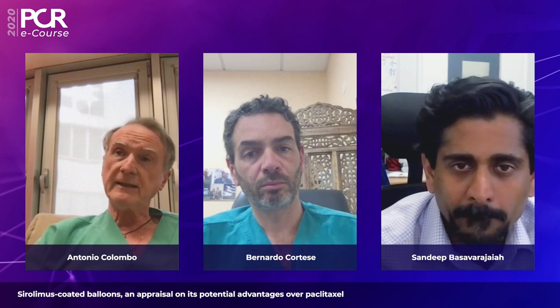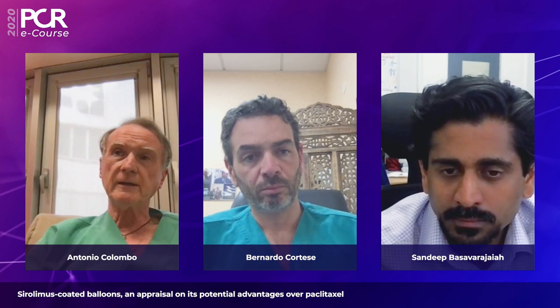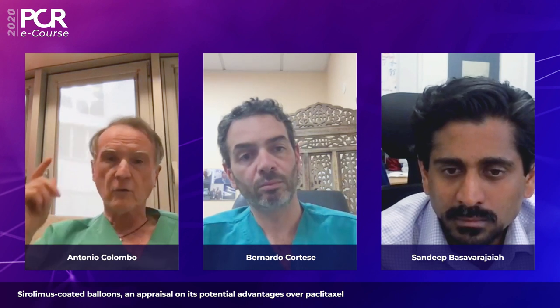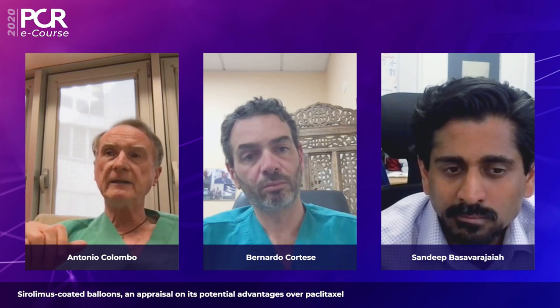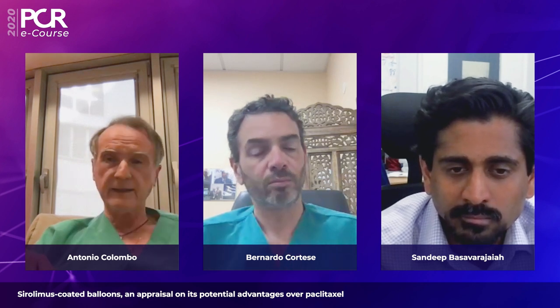And please do not dismiss also the fact that drug-coated balloon does not demand long-term dual antiplatelet therapy. And this technology, even if we did not cover this aspect in this symposium, is a good alternative in patients who cannot take a long-term dual antiplatelet therapy, who may need immediate surgery or some other procedure, or they are at high risk for bleeding.